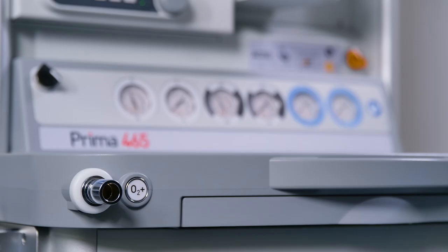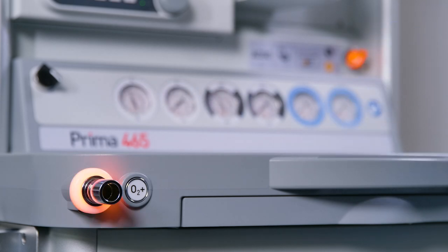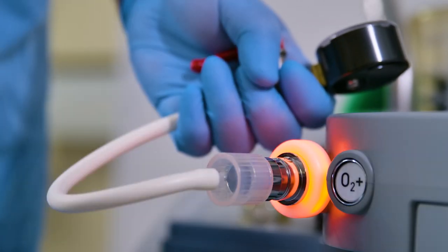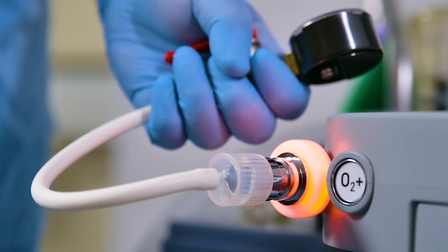Anesthetic machine and Sigma EVA vaporizer leak tests: ensure the leak tightness of the anesthetic machine by performing a back bar manifold leak test, as detailed in the Anesthetic Machine User Instruction Manual, then as detailed in the Sigma EVA User Manual.